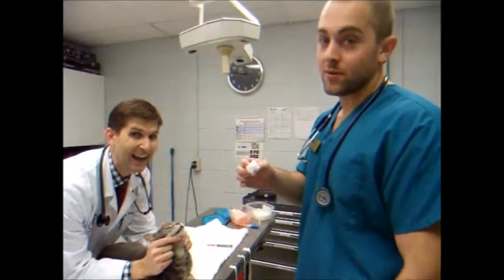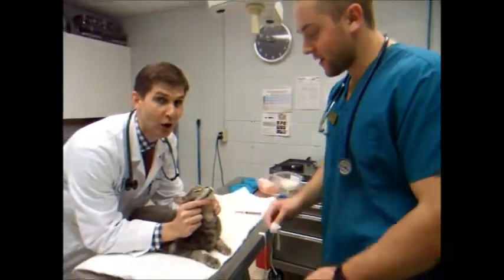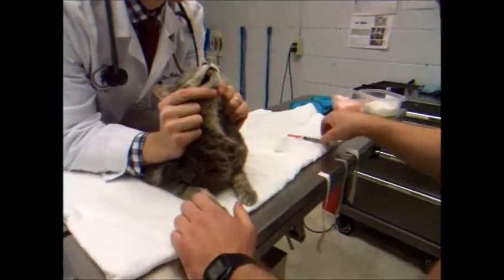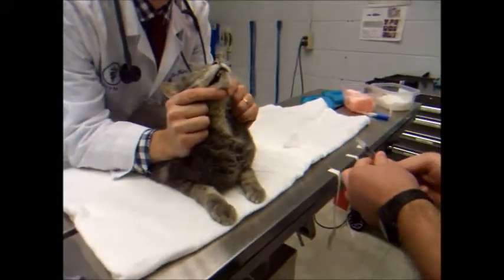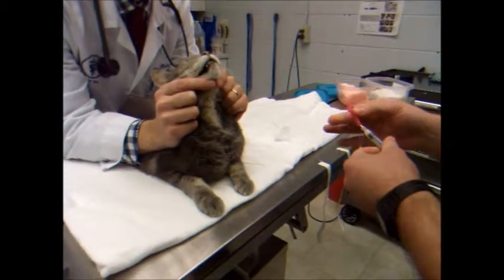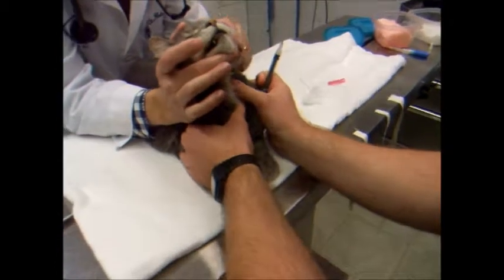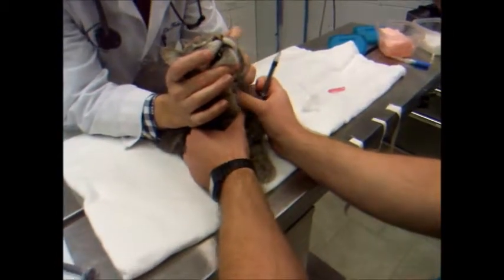Alright, I'm going to go ahead and draw some blood from a cat. We're going to do jugular and cephalic. Dr. Burke's going to restrain here. Tell me what you want me to do. Right here, okay.